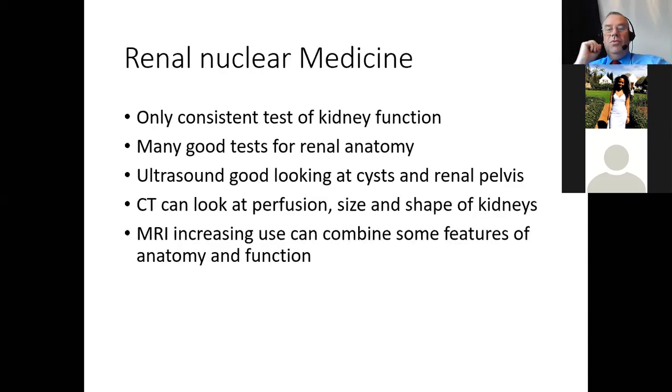So renal nuclear medicine: what I mean is that it's the only consistent test of renal function. It's the only test we can do where we can compare different tests and the differences are meaningful. We can do other tests such as ultrasound, we can do even dynamic CT if you want to irradiate the patient a lot. But the results are qualitative, not quantitative. Although I suppose renal size on ultrasound is a bit of an exception. But if you want to know about renal function, then you need to use nuclear medicine, really.